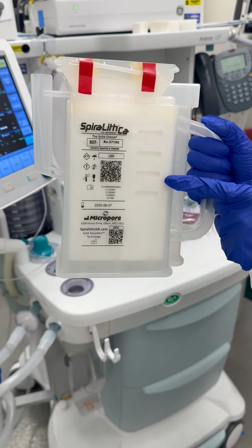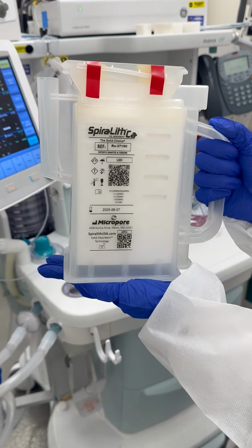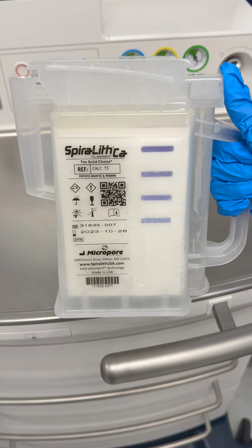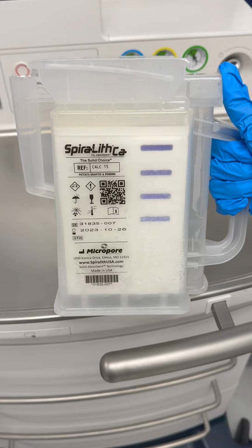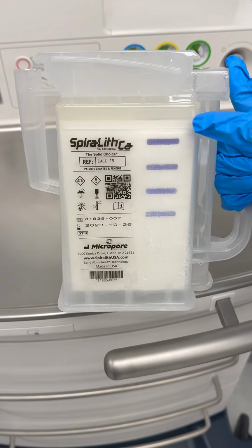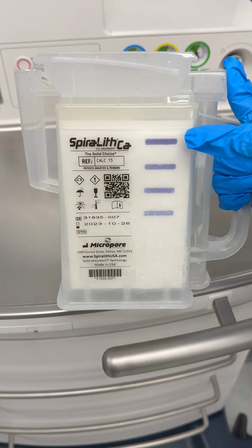The indicator windows in the new cartridge may have a very slight shade of violet or gray. For comparison, here is a reacted cartridge which has a much darker blue-violet color. As the absorbent reacts, the windows gradually change to dark violet, starting at the top and progressing downward.